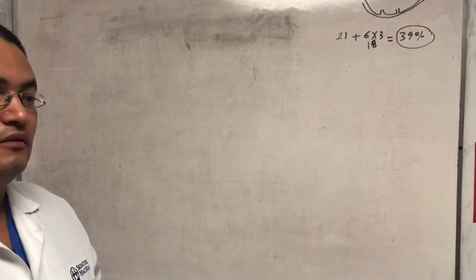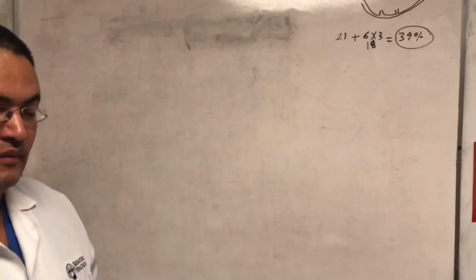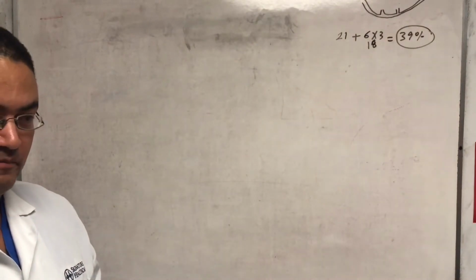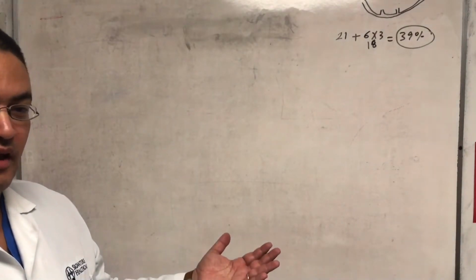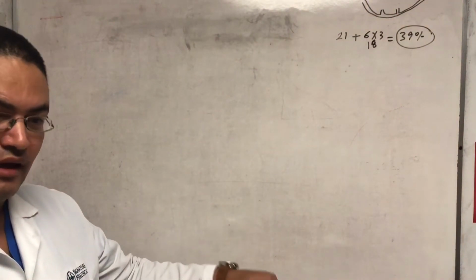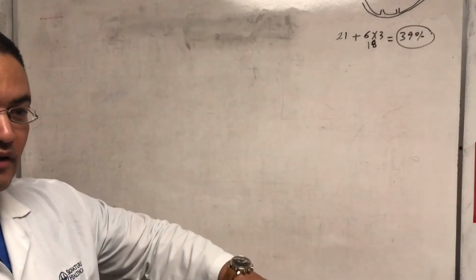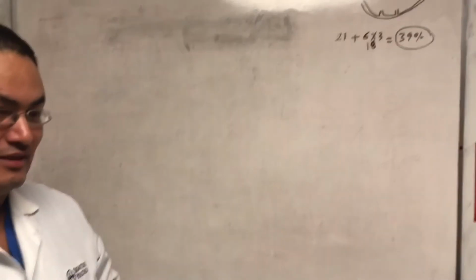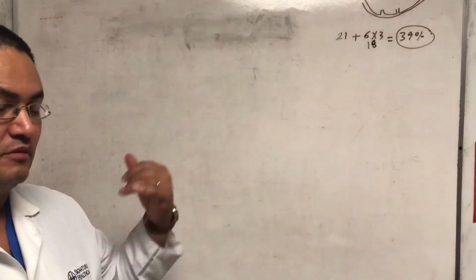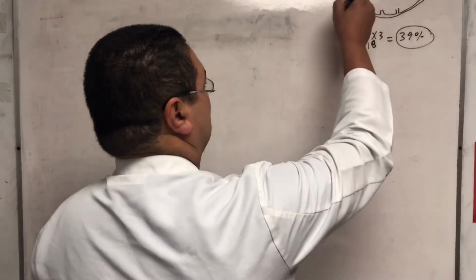So that brings me to the next thing. If I'm breathing a little bit faster, I'm now short of breath, I'm doing like this, and I'm pulling in 100 liters per minute because I'm hungry for air, what's going to happen to the FiO2? It's going to drop. So with the nasal cannula, if you stay at 6 liters per minute and the patient is in distress, the FiO2 is going to go down. While the patient is in distress, the FiO2 is going to get closer to 21% as opposed to away from 21%, because I'm entraining a larger percentage of air. So that's the 6 liters per minute.